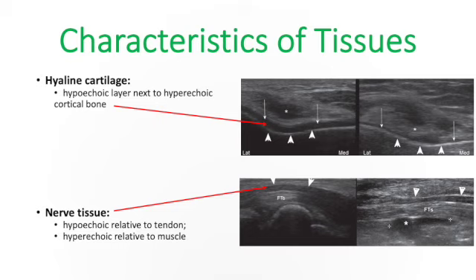So we want to make sure we have a very deep understanding of how our anatomy looks, not only in the traditional sense, but also from a superficial to deep sense as well. So definitely make sure that you practice this a lot before you actually use it in the clinic.